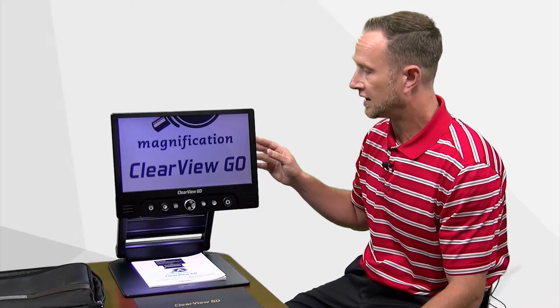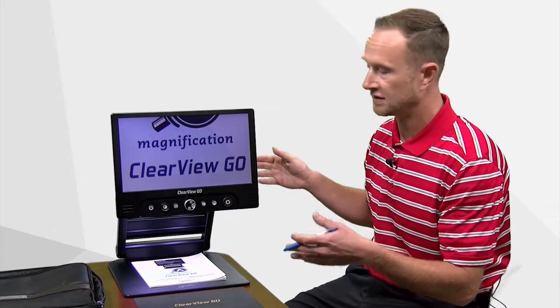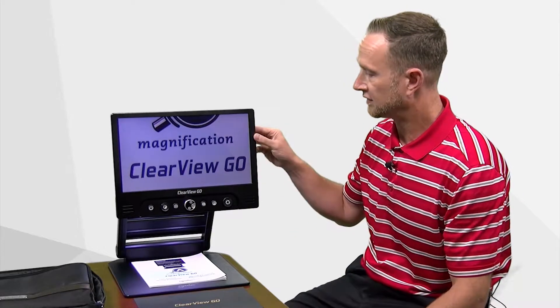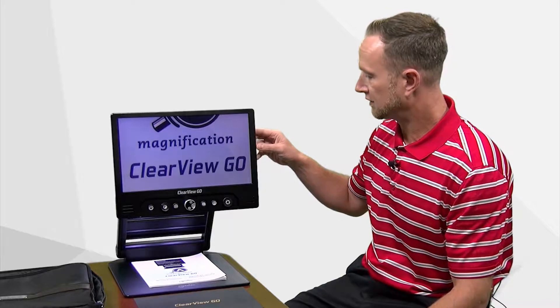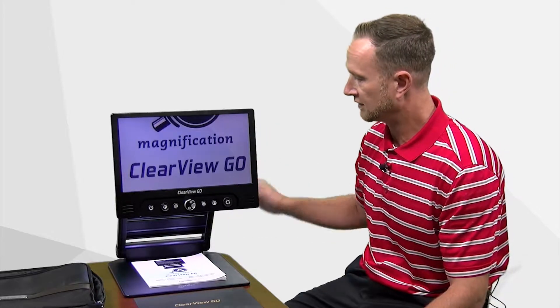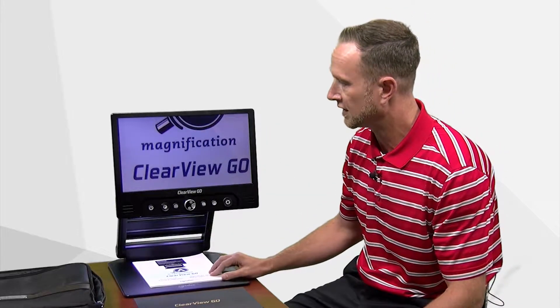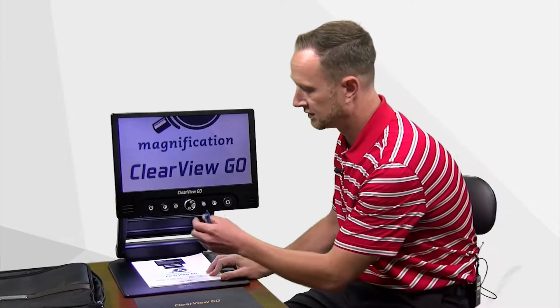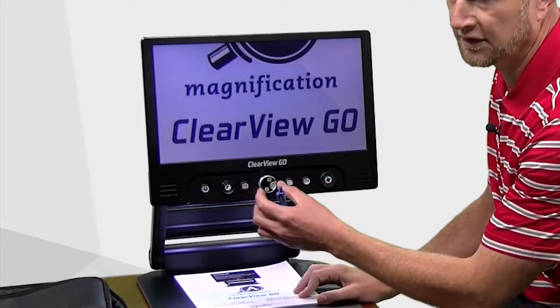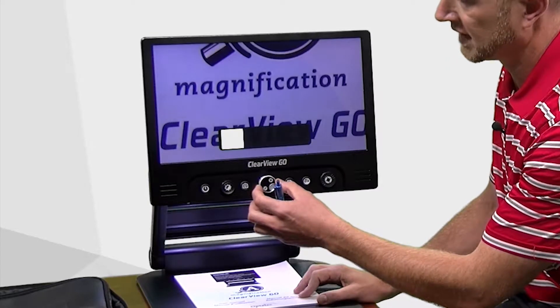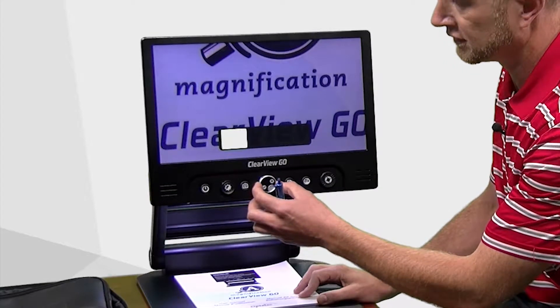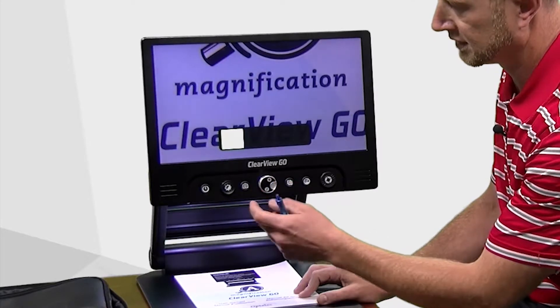So the student can sit down at his or her desk and have this unfolded and they can use this to magnify any material that's underneath. Right now I have a piece of material and this acts like any other traditional video magnifier. You can zoom in and you can zoom out.